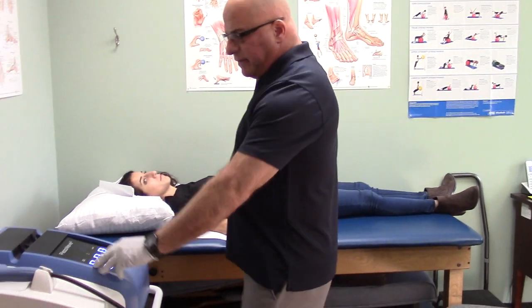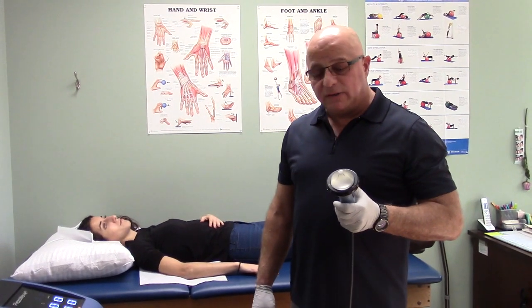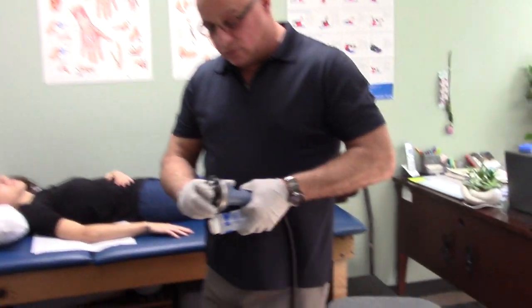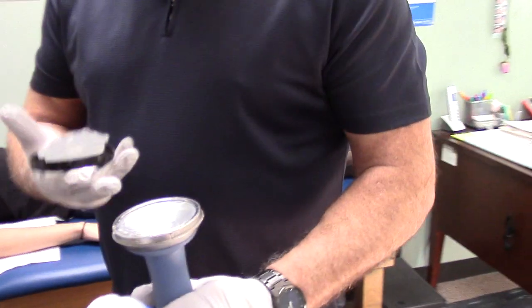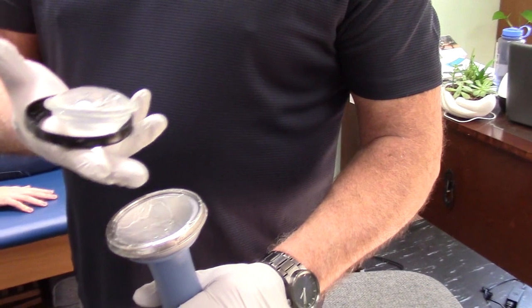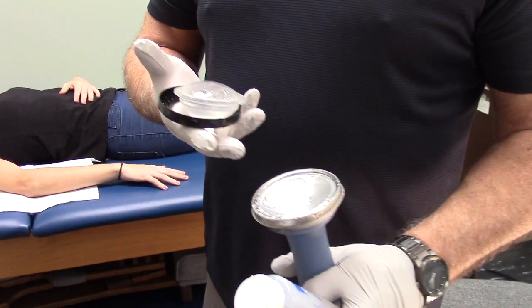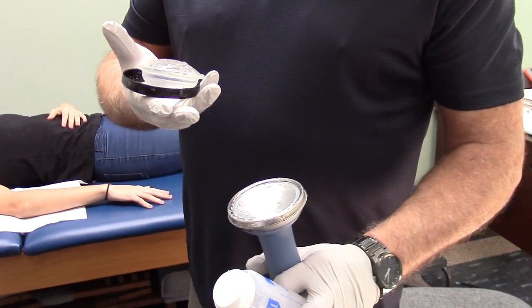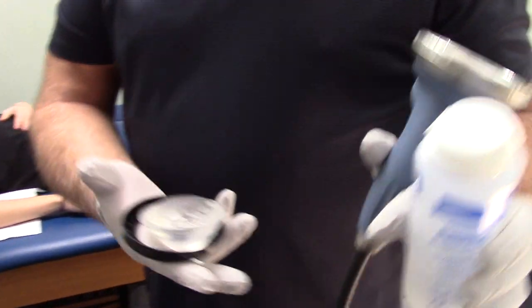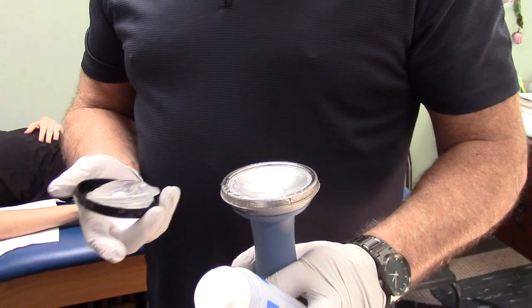The unit itself — I'm going to be using what we call the focused headpiece. As you can see, it's a concave applicator. The difference between this unit compared to other shockwave units is that this is a piezo effect, meaning it's crystals that line the applicator itself. As the electricity comes in, the crystals start vibrating and actually generate a sound pulse.